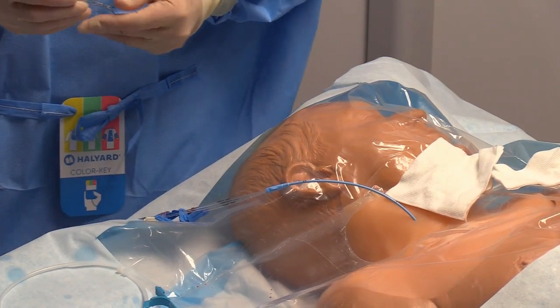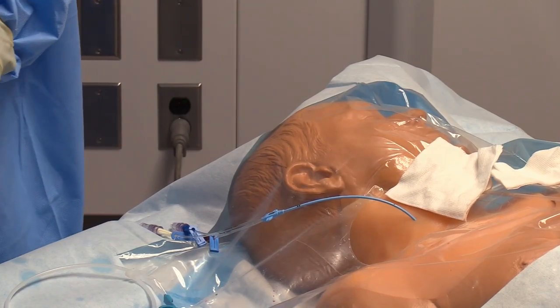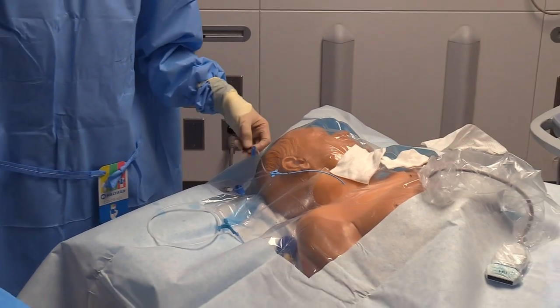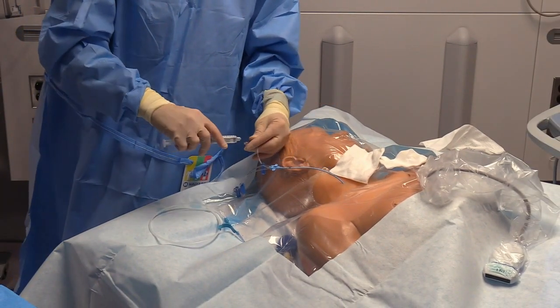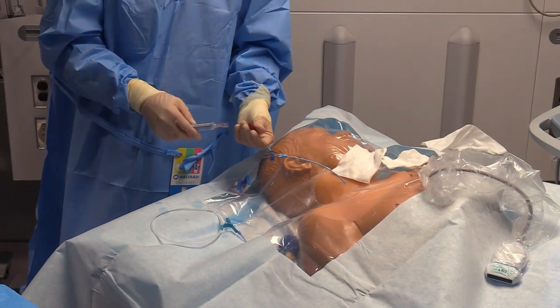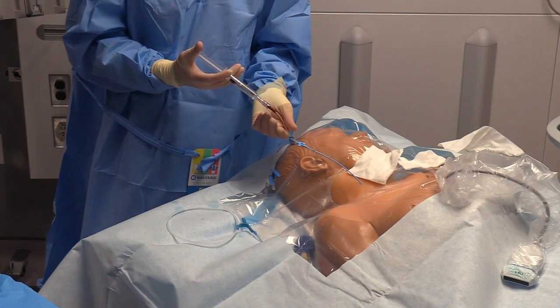Once my wire is out, there will be blood flow usually returning depending on the central venous pressure of the patient. In patients who are very hypovolemic, it may not, so you want to avoid if they're taking large inspiratory volumes and air embolism there. I haven't seen that, but that's definitely a complication that's been spoken about. And so you want to make sure that this patient has fluid about to go through there and a cap on after you remove the wire.